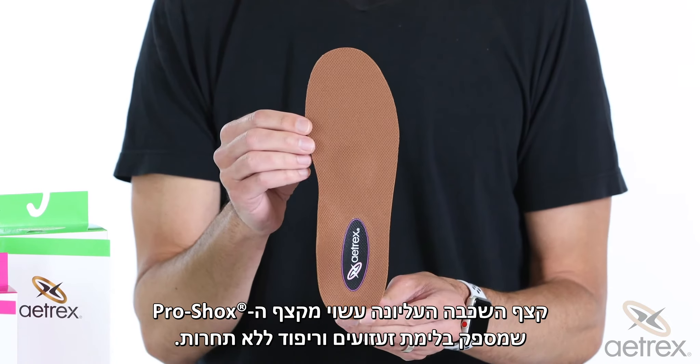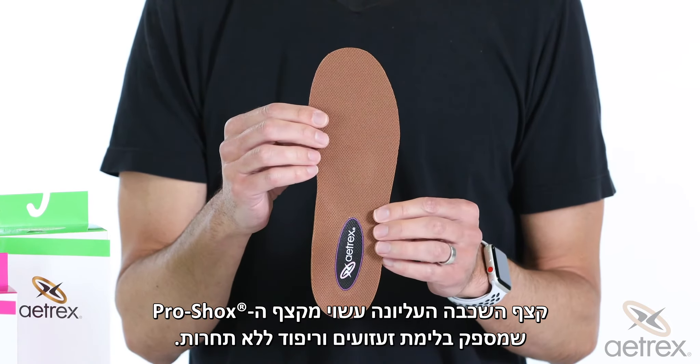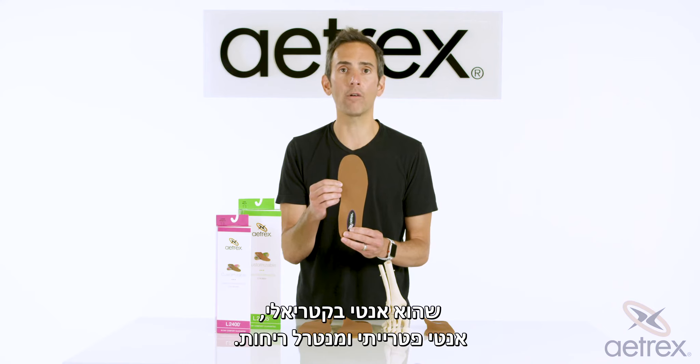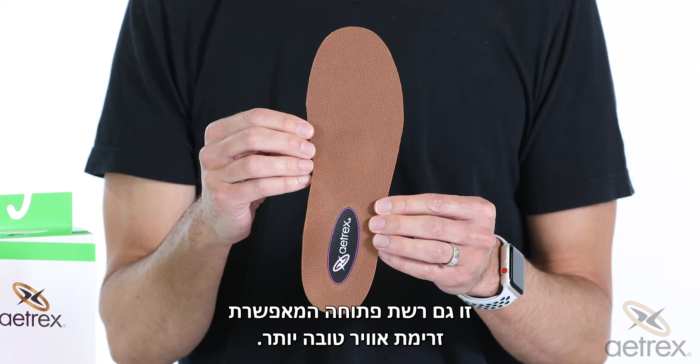The top layer foam is made from pro shocks, which provides unmatched shock absorption and cushioning. The top is made from copper guard, which is antimicrobial, antifungal, and controls odor. It's also an open mesh, which allows for better airflow.